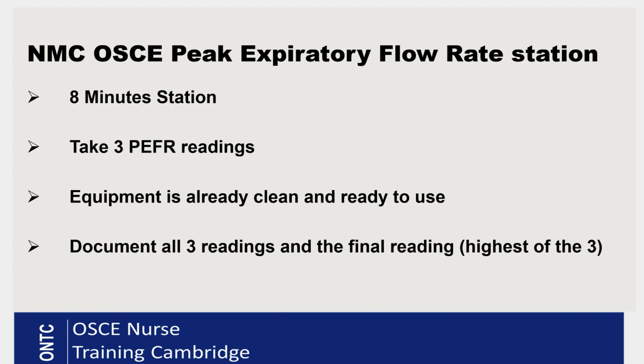You have to take 3 peak flow readings with your patient. Your equipment, they tell you, is already clean and ready to use, and then you're going to document all 3 readings and also the final reading. Now final reading is the highest of the 3 readings, which should be recorded on your recording chart.